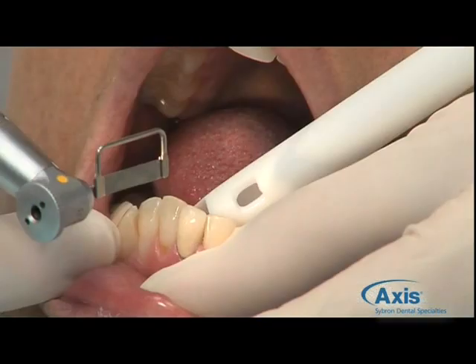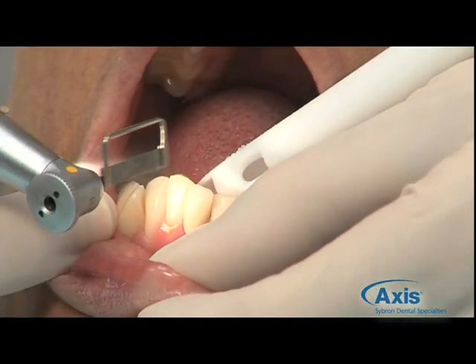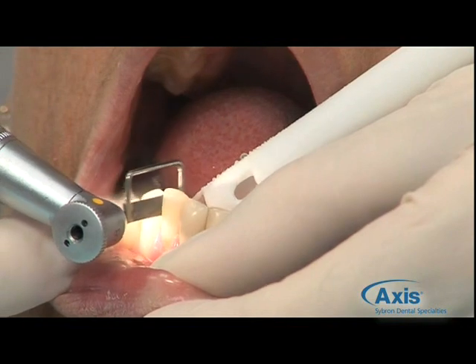This is the fastest and most efficient way to do IPR. I start with a 25 micron grit and then move my way up to the 60 micron grit. I personally prefer to use the one-sided ortho strip because it allows me to select between which tooth I'd like to abrade, producing a more aesthetic and a beautiful result, especially when there's not symmetry between the teeth.